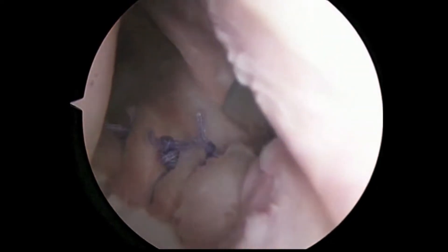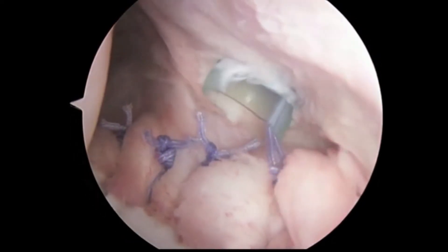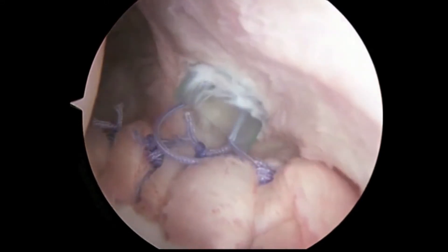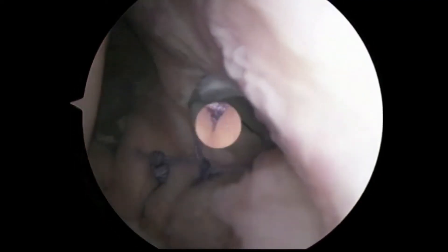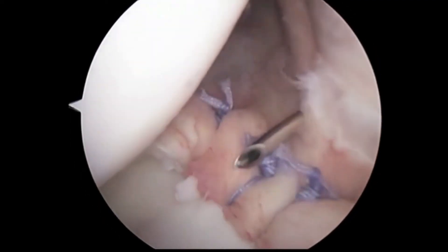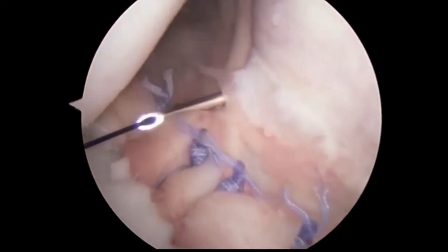When we get to the top suture, we can see that the tissue has come back over to the bone and is in a good location for healing. The final step is to close our portal by placing another suture.